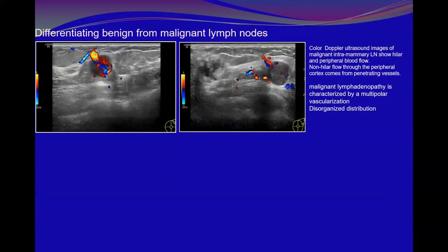This is also my patient, okay? Within the breast, toward the axillary tail, I can see a rounded lymph node instead of a normal oval. Being rounded, it will be suspicious. Then when I used color Doppler, look for the vascularity. Look for the vessels coming from the hilum and how it is hyperemic.